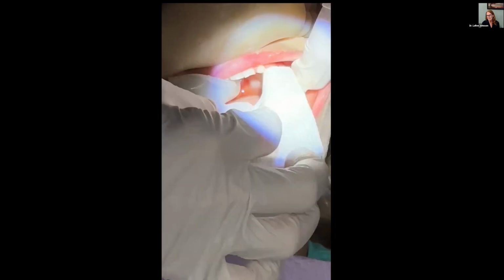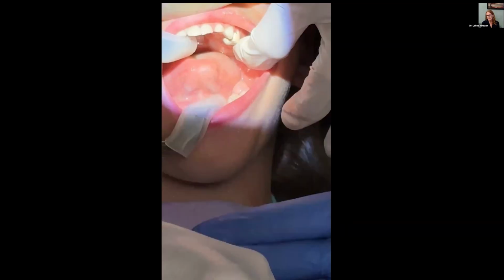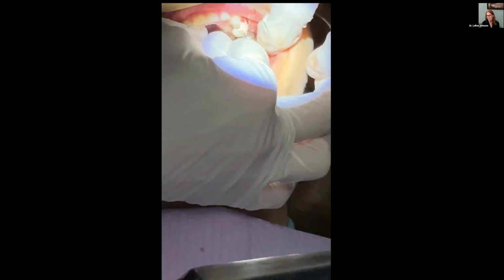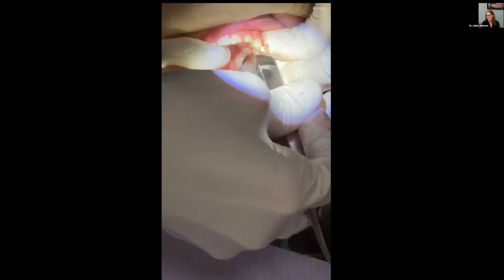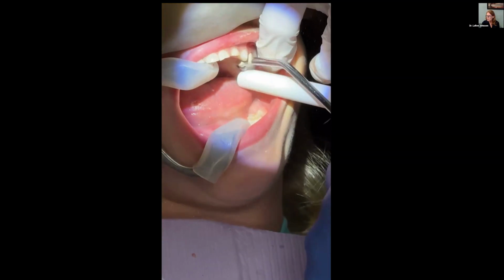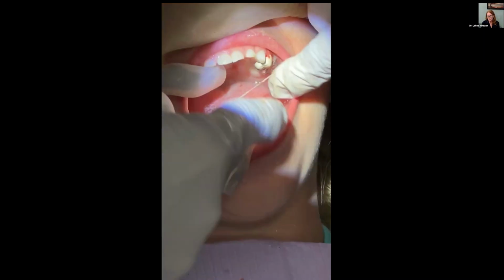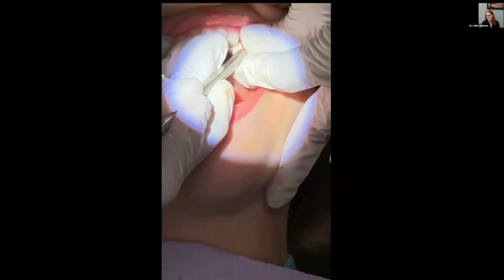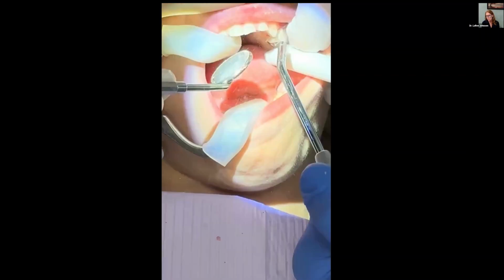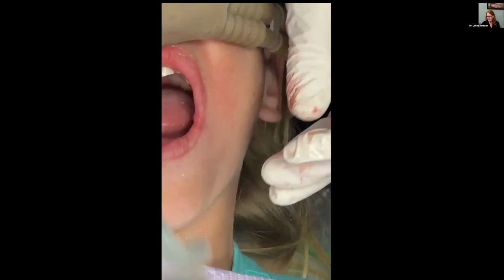And this is us cementing these BioFlex. And then this is a 10-minute procedure, start to finish with this little friend for 2 BioFlex crowns. I'm here to tell you, you shouldn't be using the pusher on BioFlex. I will tell you from having 4 recare cycles of BioFlex, what's more important is having a fully seated BioFlex versus how you're pushing it down or what you're choosing to do. And that was that case.